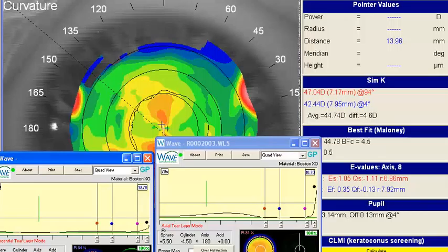So my recommendation might be to relook at that design, see if it might be helpful to redesign it without averaging the corneal cylinder. Go up a little bit larger in diameter, and hopefully that'll keep that lens from rocking as much and stabilize it so it doesn't pop out. I think you're really close on these designs. They look good. I'm glad to hear you're successful in the left eye, and hopefully with a couple small adjustments you'll achieve the same level of success with the right eye.